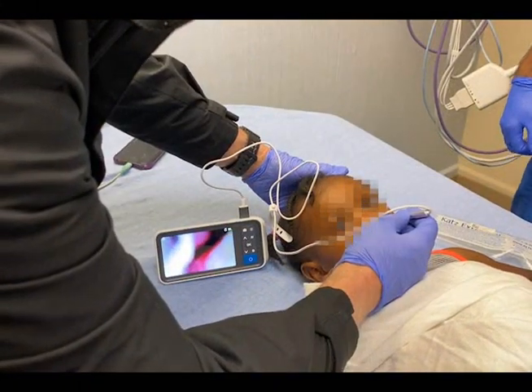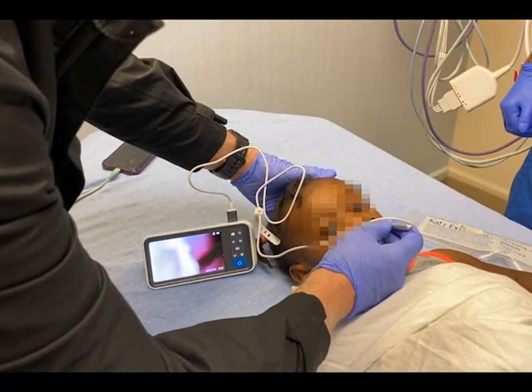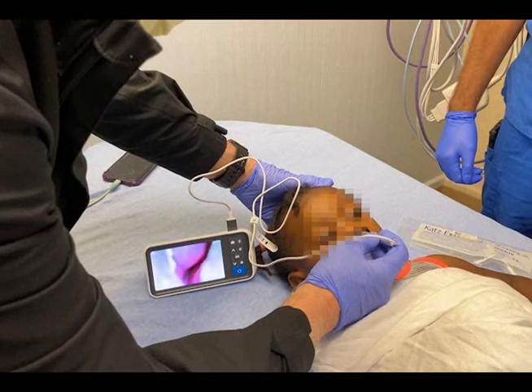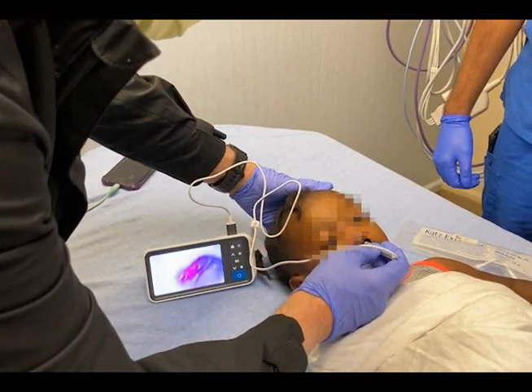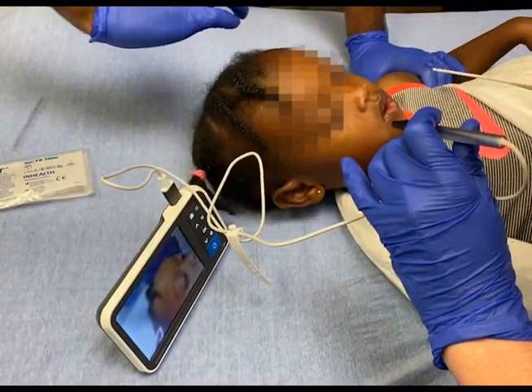Oh yeah, look at that. See the nice turbinates and the boogies. Mm-hmm. Okay, I'm gonna go back over here. And there's that strange object down there. Come up to the head.